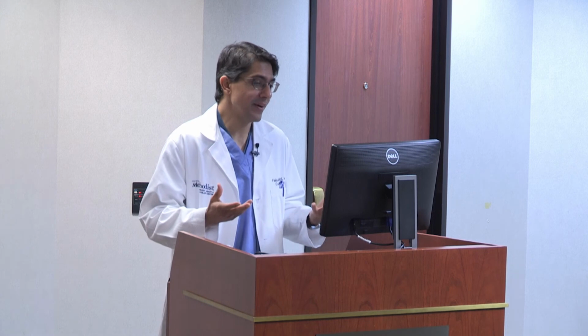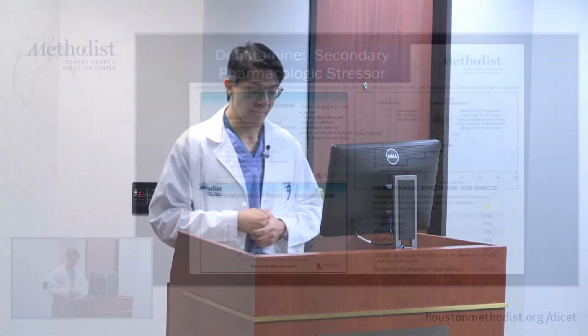If they're taking dipyridamole and it's been under 48 hours, this is your agent. Recent caffeine intake, less than 12 hours. If they have, again, significant lung disease or advanced degrees of heart block. Those are the most common patients, very rarely seen I would say, who could be candidates for dobutamine.